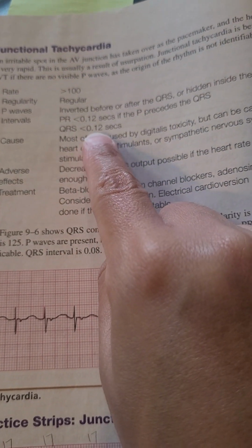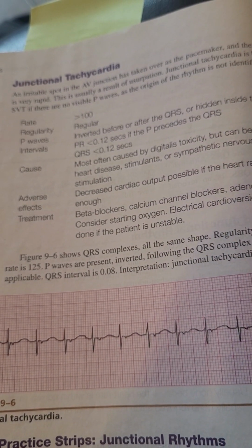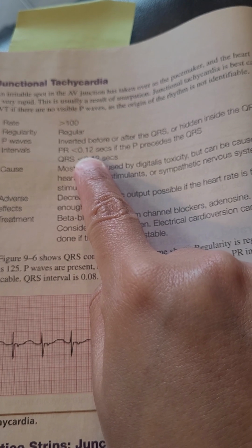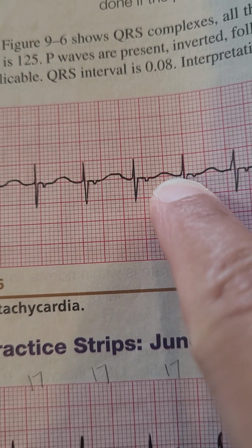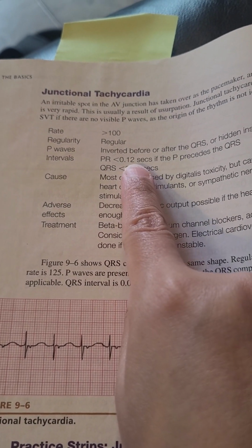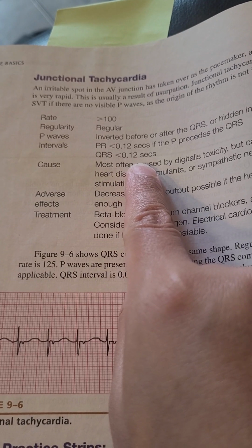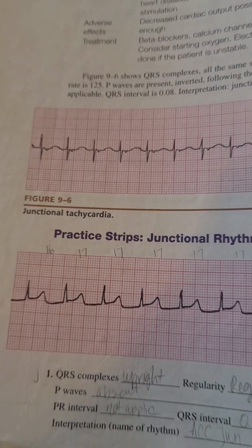PR interval needs to be less than 0.12 seconds if the P wave precedes the QRS. If you see one, it should be less than 0.12 seconds. So if you see a P wave here, it needs to be really close to the QRS, less than 0.12 seconds. QRS still remains the same, less than 0.12 seconds.